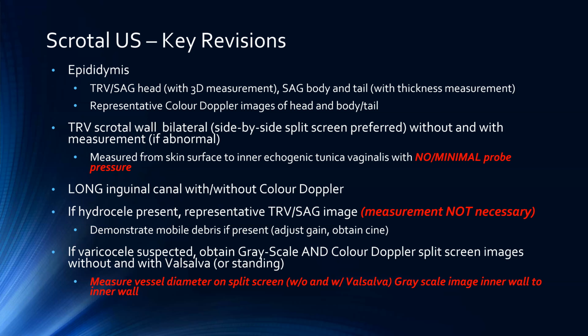For the most part, we can really just be grading these from a subjective perspective. Are they small, medium, or large in size? And then really just documentation of any mobile debris, similar to with the bladder. Just provide a cine if there is debris, just showing mobility of that.